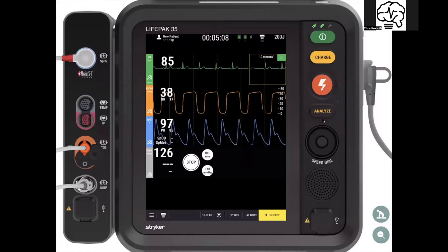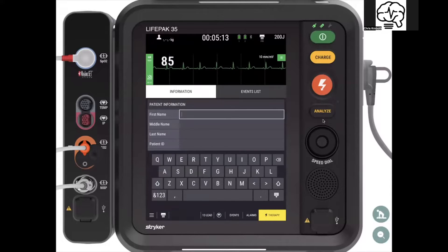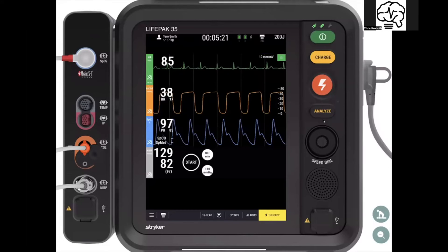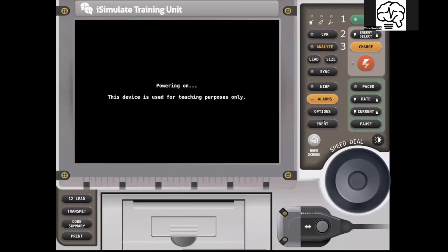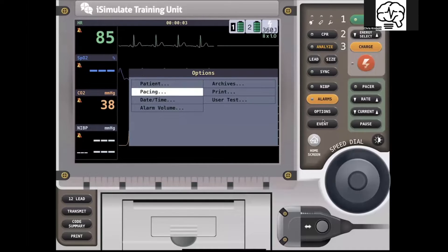It has the ability to easily enter patient data — you can just tap patient data and start typing. You can put in age, sex, weight, and all that. In terms of the LifePack 15, you'd cycle through and then target it with the dial.